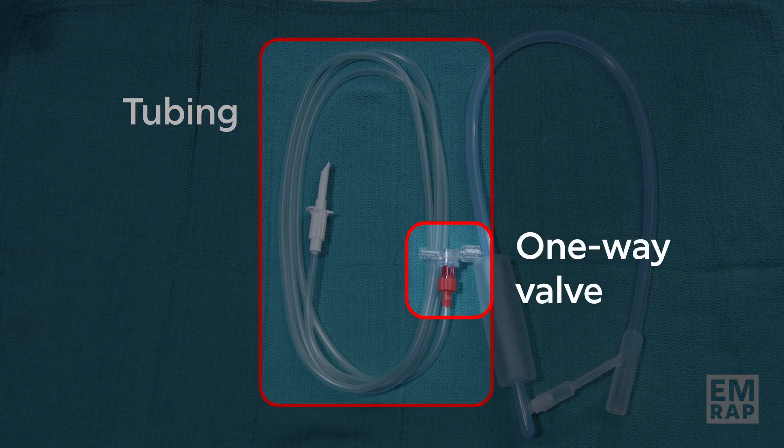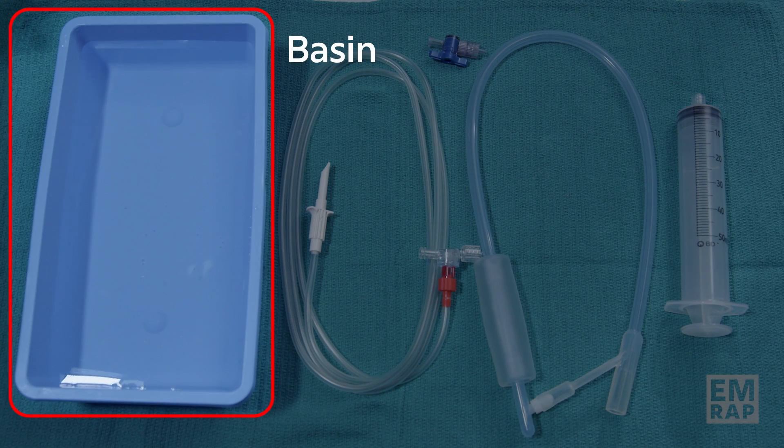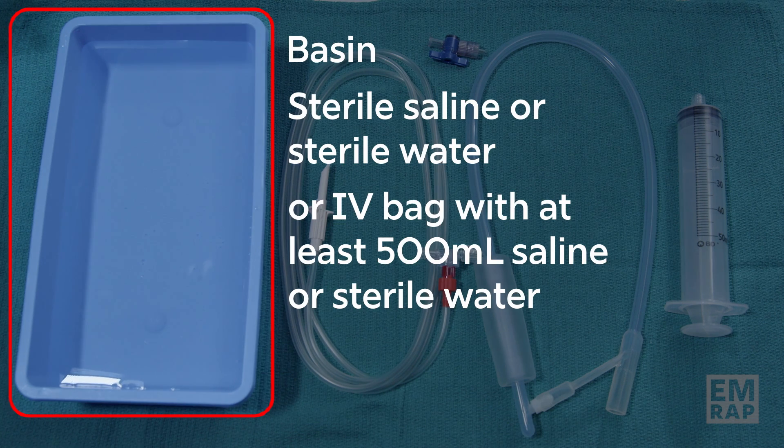The kit contains a Bakri balloon, tubing connected to a one-way valve, a stopcock, and a 50 milliliter syringe. You will also need to gather a basin with sterile saline or sterile water, or an IV bag that has at least 500 milliliters of saline or sterile water.